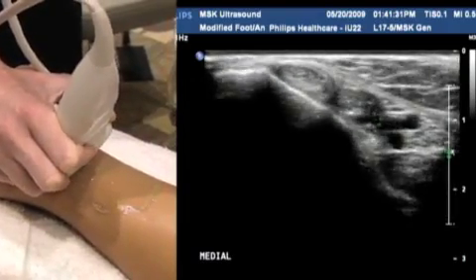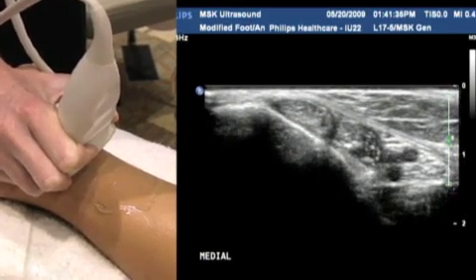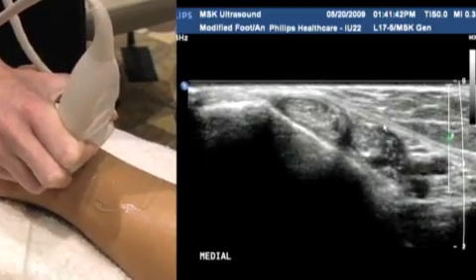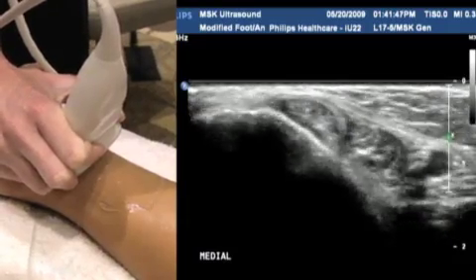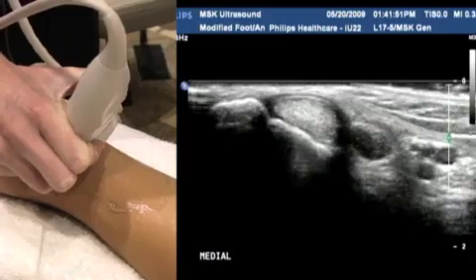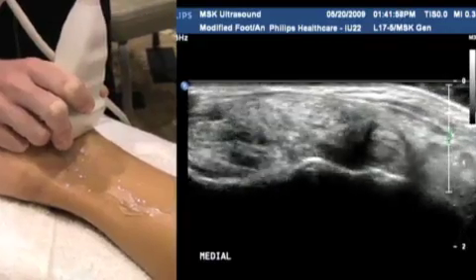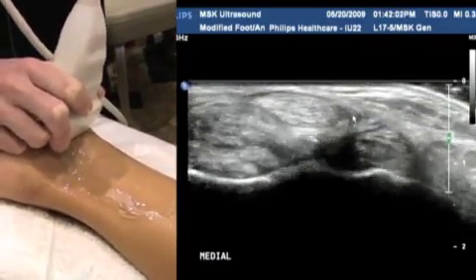So let's go and focus on our tendons now. Let's look at the posterior tibial tendon, first of all. It's the guy right at the top here, right here. Okay. Again, we're going to start quite proximally and we're going to follow it all the way down, heel toeing as we go, making sure it stays nice and echogenic. As it goes around the malleolus, it can be difficult. Again, underneath the retinaculum that you can see here. Following it all the way down distally.